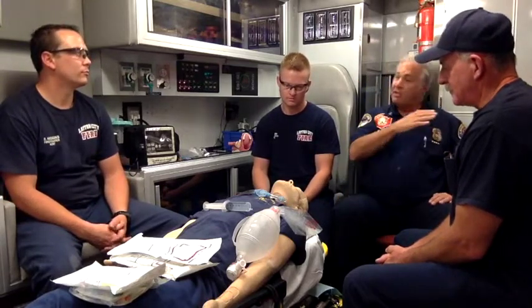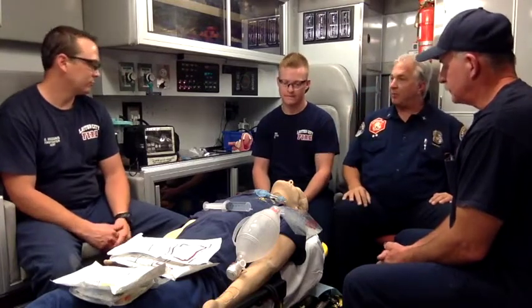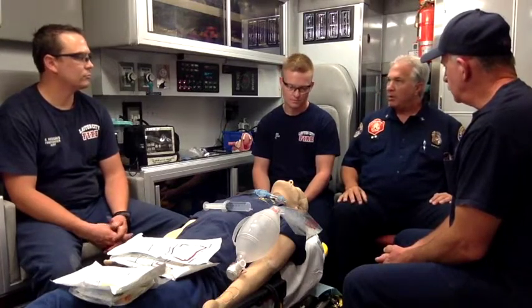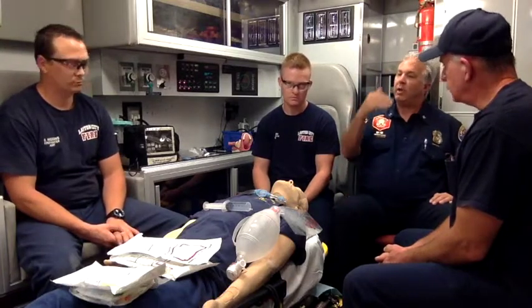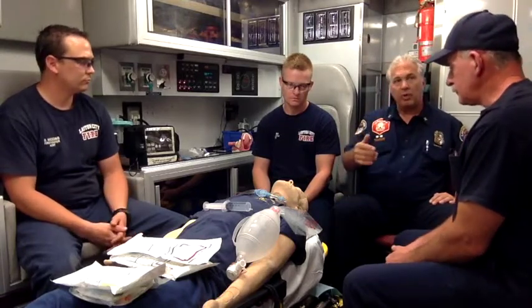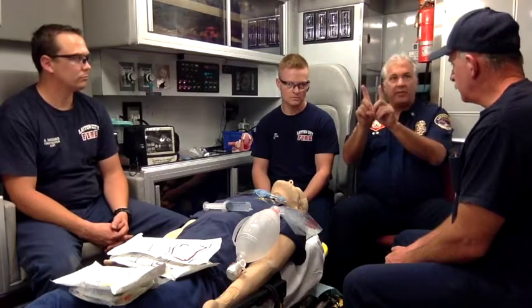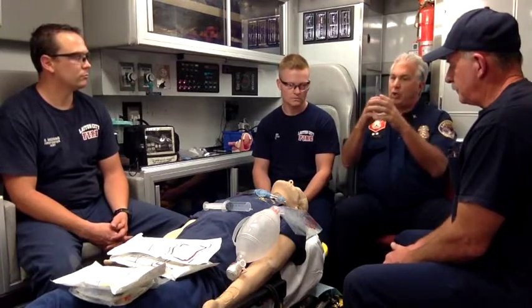Now there was a bunch of variations that happened, including the oropharyngeal airway that got developed before that. But the one that we classically think of the most is the LMA, and that started in 1981 and got refined through 1988. And then that gave way to the first generation supraglottic airways that hit pre-hospital, which was, remember the Combitube that we used to have years ago? That was that great big long one. It had 2 different ports that you'd ventilate through because you could inadvertently intubate with that thing. And it had that huge cuff to it.